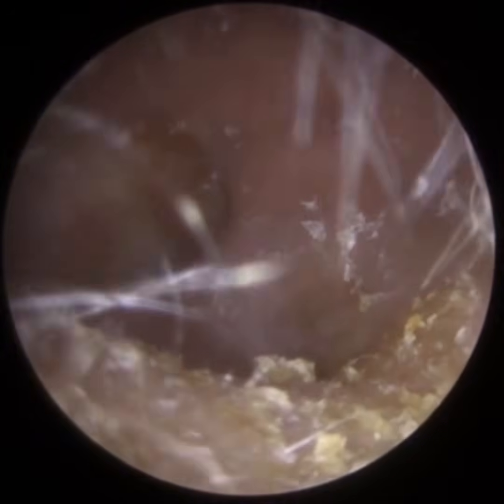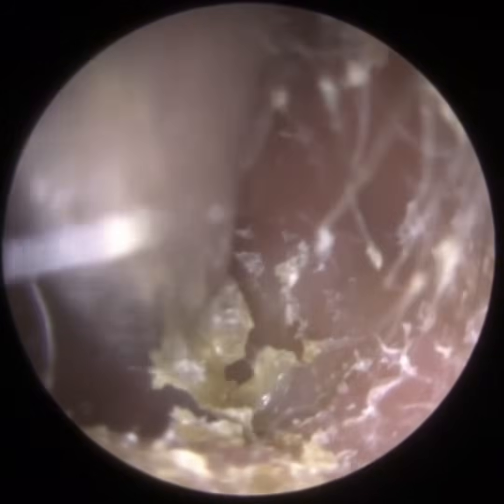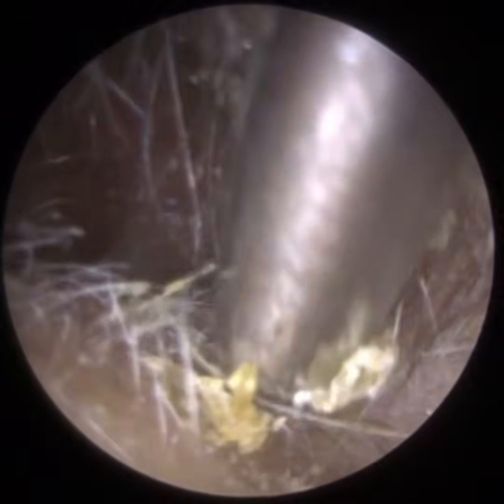And whilst we're doing this, we're going to make sure we don't cut into the ear canals. By cutting into the ear canal, if we abrade it, the patient's likely to develop a secondary infection because the mid part of the canal, the deeper part of the ear canal, is exposed. So this skin acts like a protective layer. We don't want to get through the fresh layer of skin that's not yet dead and is still lining the ear canal. If we cut or abrade it, it'll allow bacteria to enter deep into the ear canal, causing a secondary infection.